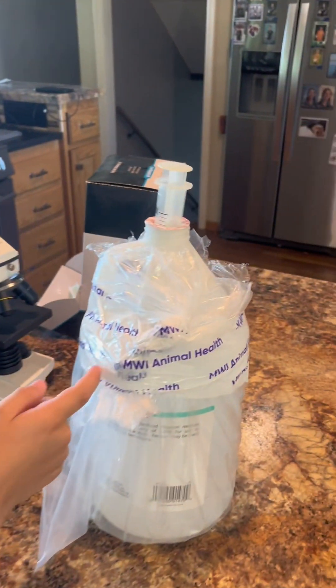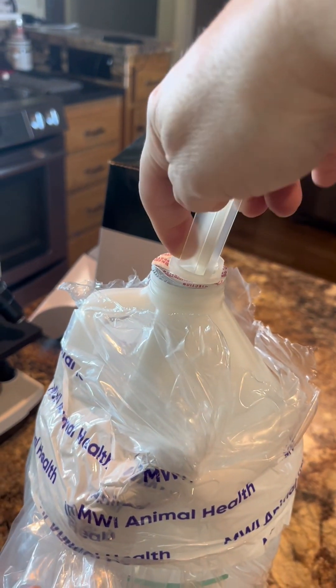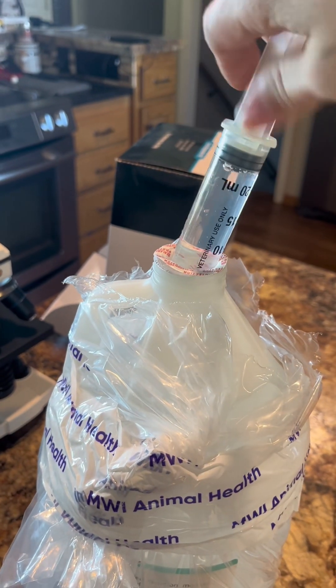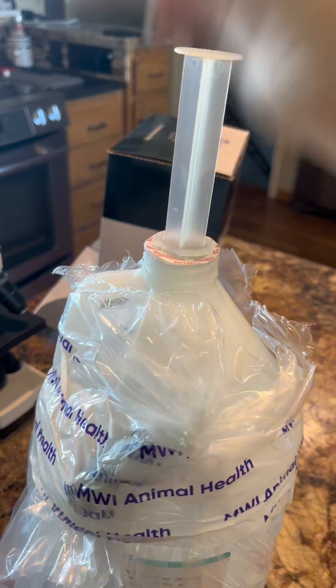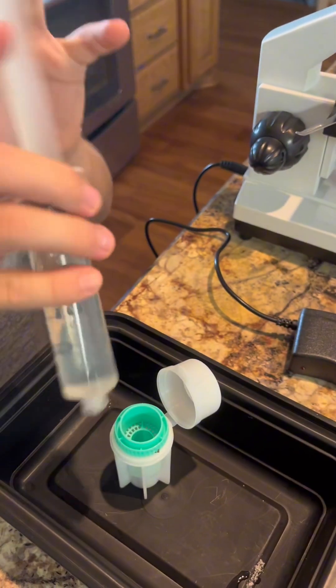Then you put the syringe inside the fecal kit and scrub the fecal. You draw up a large amount of the Fecasol. This is basically like a sugar float that helps the eggs float to the top — this keeps it less messy. Then you put some fecal inside of here.